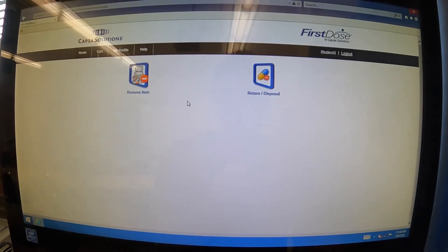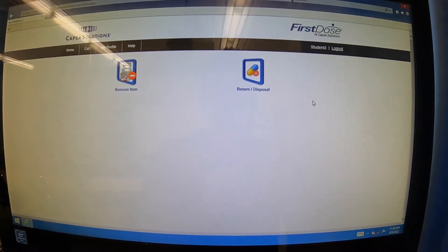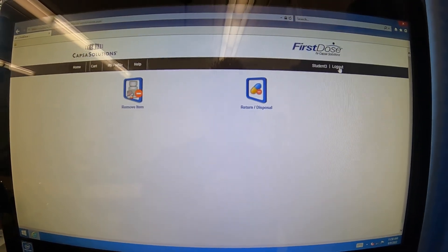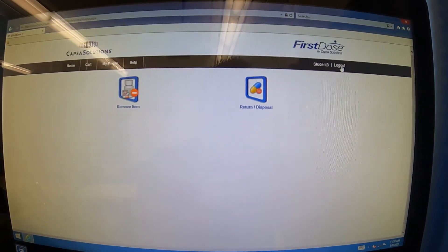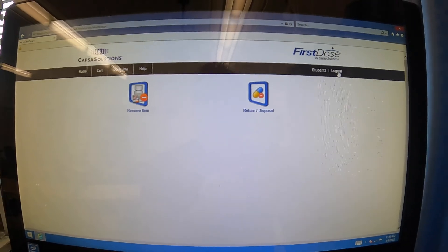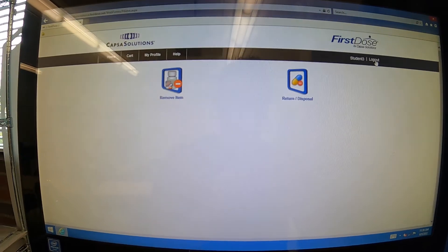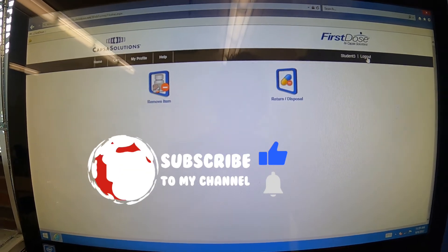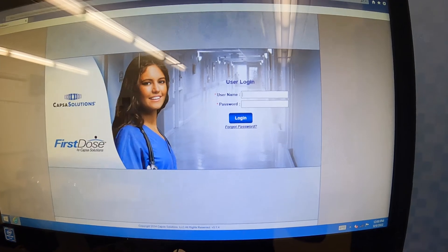Once you've successfully pulled the medication, you'll be left with this screen. You want to make sure that you log out — that's very, very important, because you don't want someone to pull any medications under your name. For example, if you're in the hospital and you forget to log out, some other nurse could come behind you and withdraw medications. If they withdraw a narcotic, benzodiazepine, or something like that — those are controlled substances — they would all be linked to your account, not theirs. So make sure you hit log out and it takes you back to the sign-in screen.